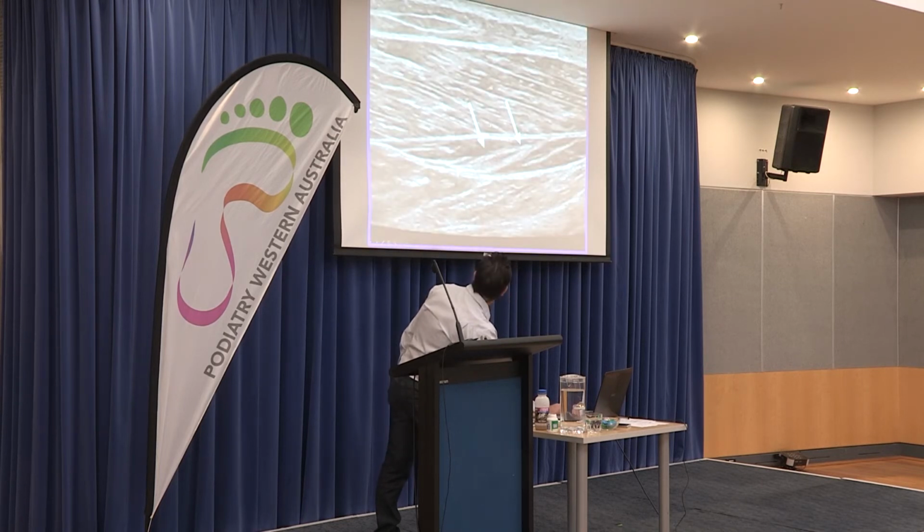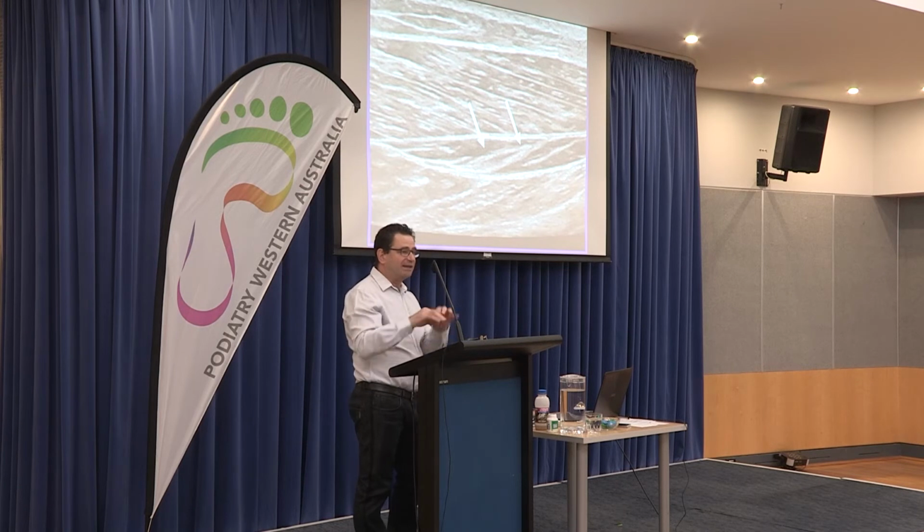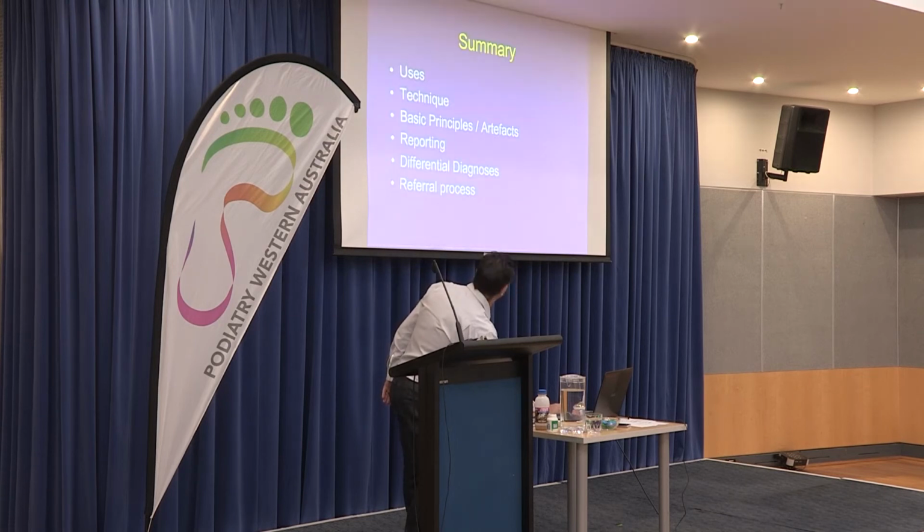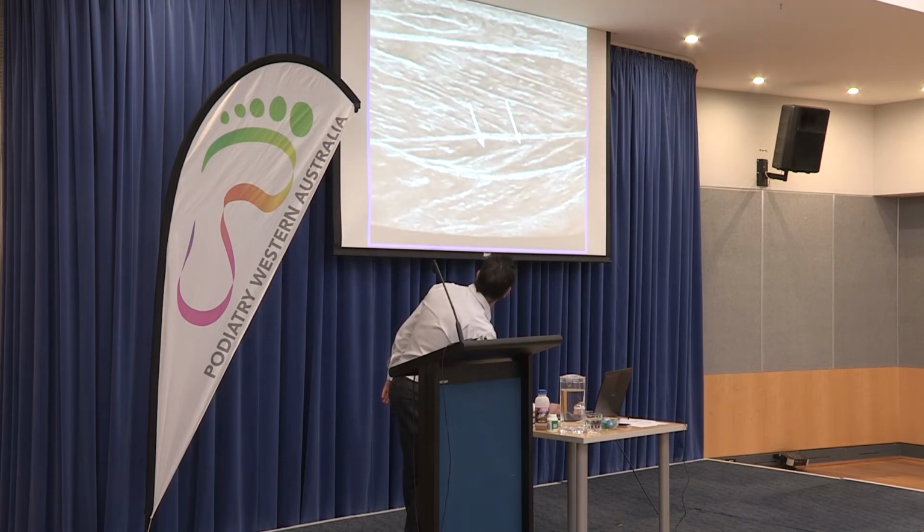And so what Eamon's been doing is adhesiolysis, where he's been injecting normal saline into that aponeurotic plane. As he injects quite a large volume of normal saline, it separates out the scar. What the arrows here are showing is that most of this is injected normal saline in that patient, and you can see all these little fibrous adhesions that are outlined by all the saline circulating around them.